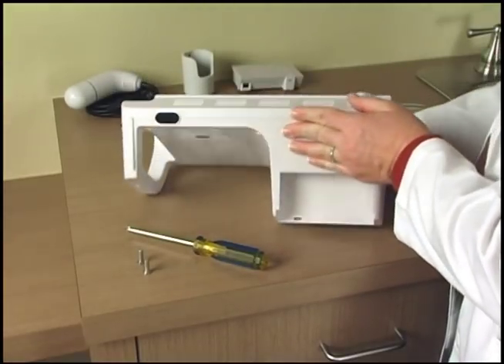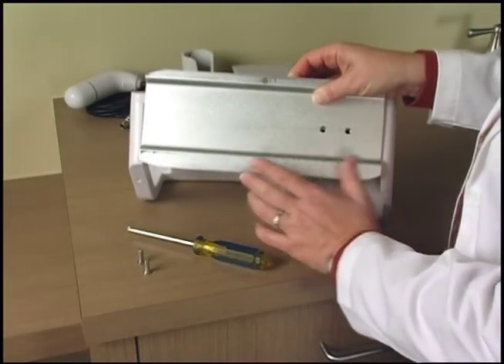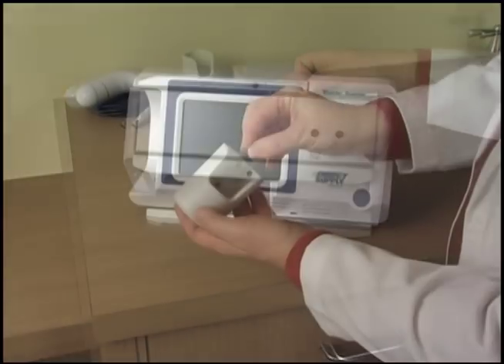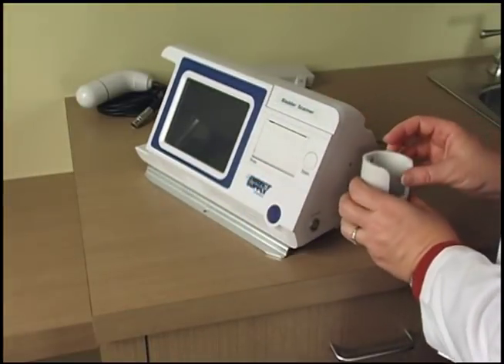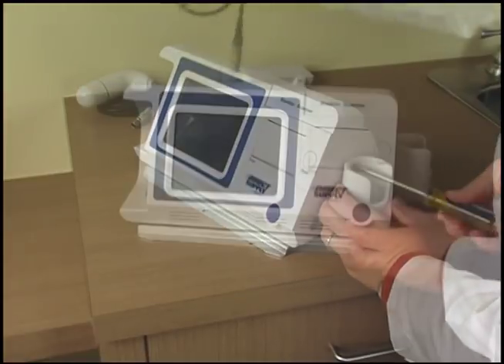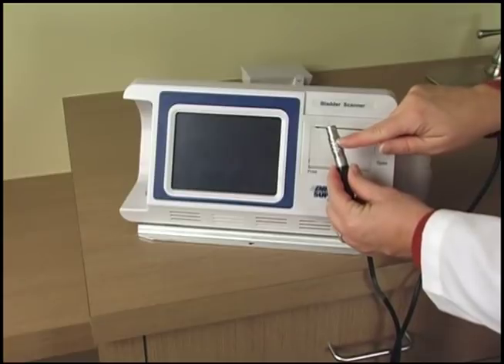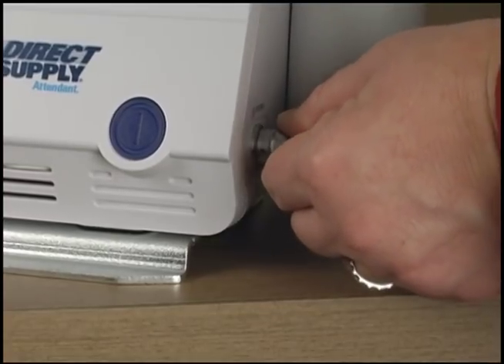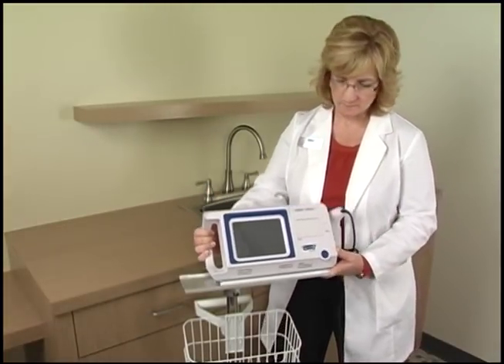If you've purchased the optional stand, first connect the metal base plate to the bladder scanner using the two Phillips head screws included in the stand kit. Assemble the stand by following the included instructions. Connect the probe holster to the right side of the scanner with the two included Phillips head screws. Place the probe in the holster. Align the red dots on the plug and the probe socket to connect the probe to the scanner. Slide the bladder scanner onto the stand and lock in place.